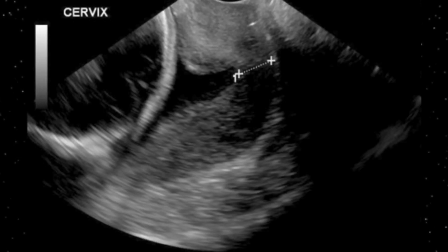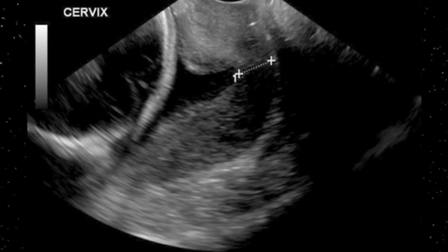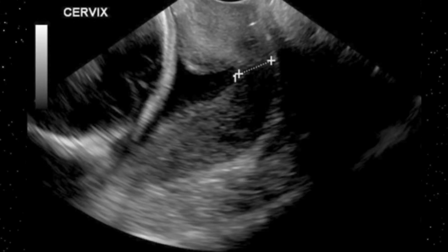That's the reason the internal os was quite dilated, and because of that marked dilatation, the membrane has gravitated downward into the cervical canal, and only less than 2 centimeter area has been left to allow the internal membranes to come out. So this is a quite serious case.